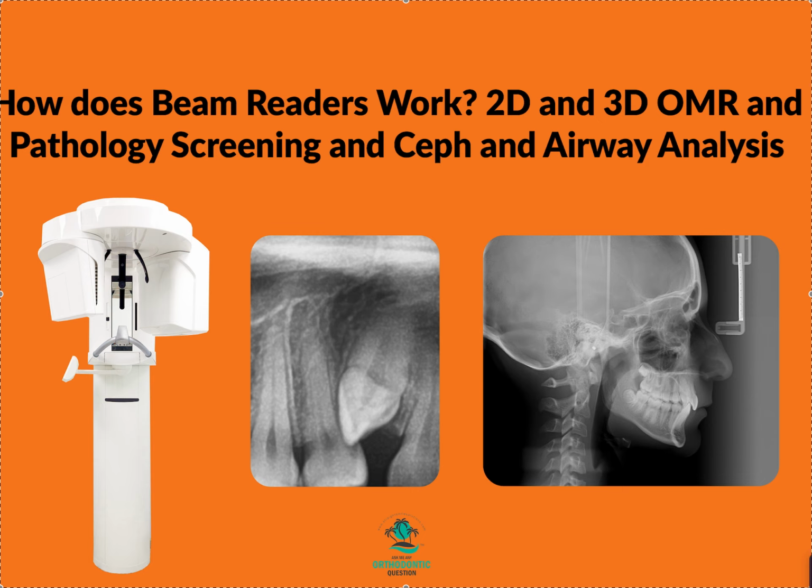Remember, if you're taking a CBCT for whatever reason, you are responsible. As far as I know, you can check with your liability insurance and with your own Dental Practice Act in your own state or country. But if you are taking a CBCT, you need to read it, even if you're only looking at one area, say for an implant for number 14. If you take a full CBCT of the whole area, every area that you image, you are responsible for interpreting. If you don't know how to interpret it, you need to upload that image and have somebody interpret it for you, because if there's some pathology at another site and you don't notice it, you are liable. That is my understanding. If you're not sure, check that out.